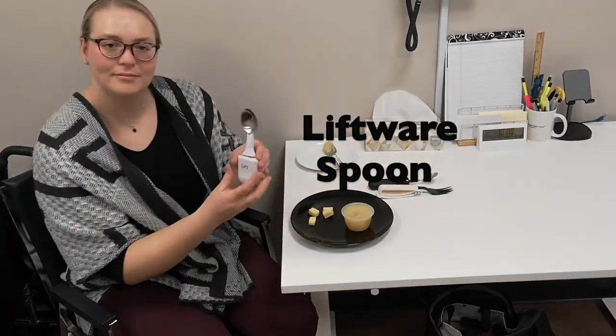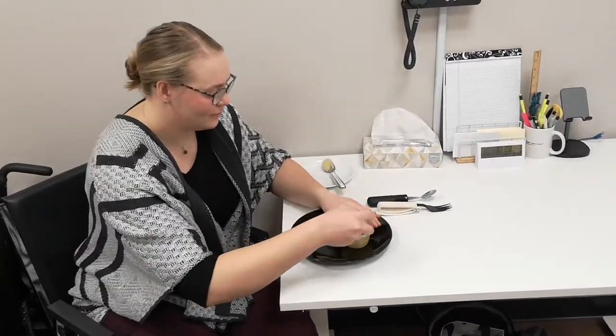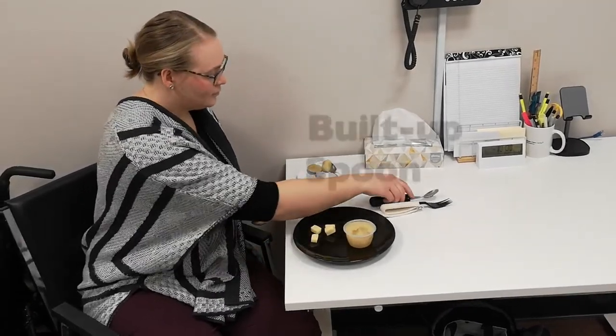Another option would be smart technology, such as this Liftware spoon. This is designed to improve stabilization against tremors or shaky hands, although these can be a more expensive option.